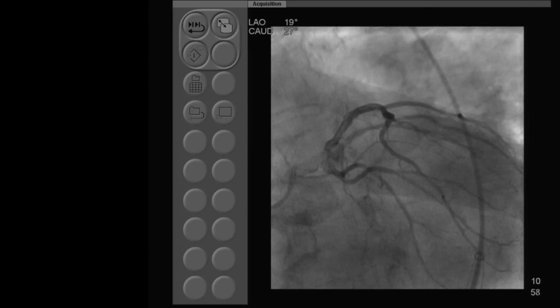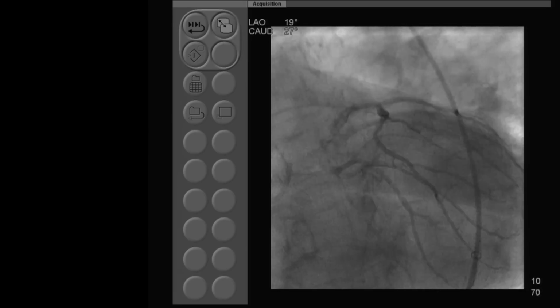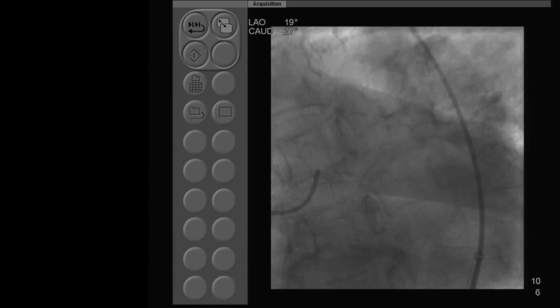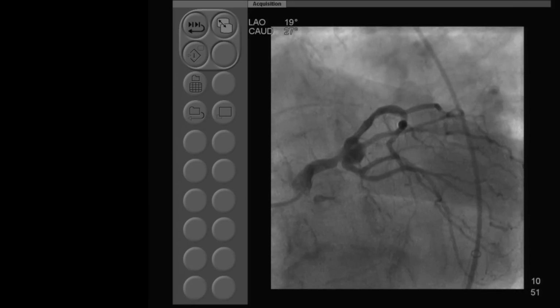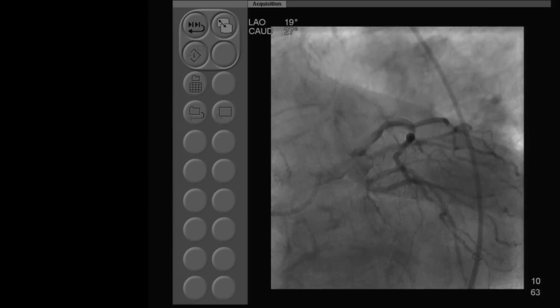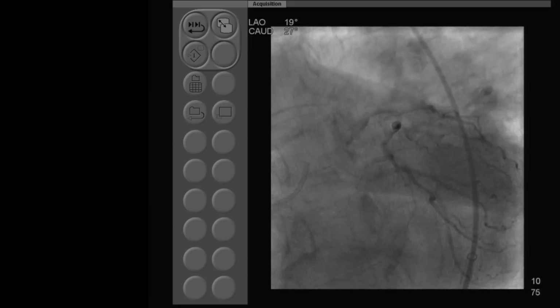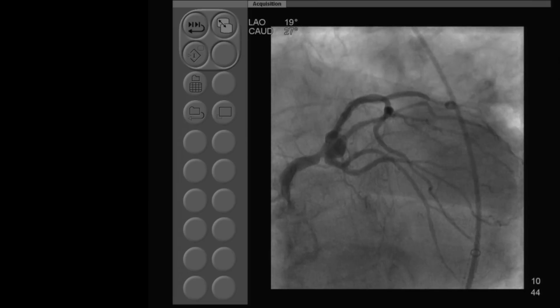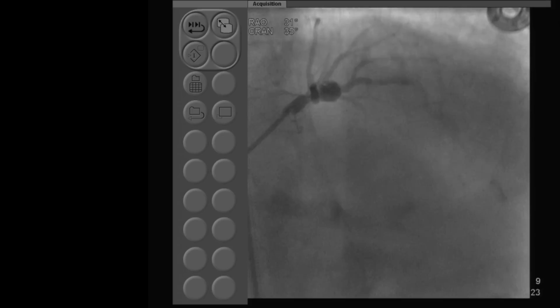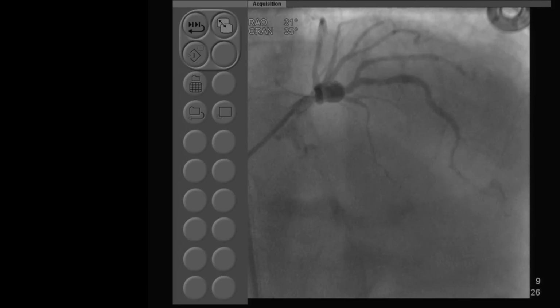Actually, maybe what happened is this: the angiogram which we put in the webcast, the e-blast, was in May, almost 7 months ago, May 14, 2018. The patient still continued, CABG was recommended, but he did not go for it, and of course came for consultation to Anu and agreed to PCI. But the key is that this aneurysm has become bigger. We have the old angiogram from May, it was in the LAD. So I think it's just the appearance of the aneurysm. It is definitely coming from the LAD, because it was coming from the LAD a few months ago, and it just has become bigger.